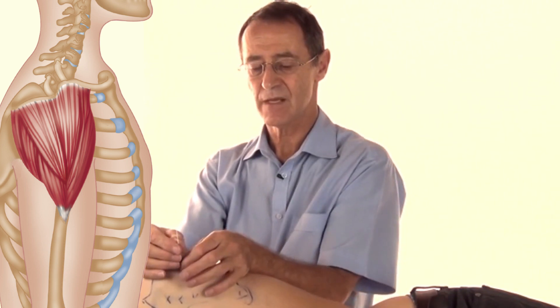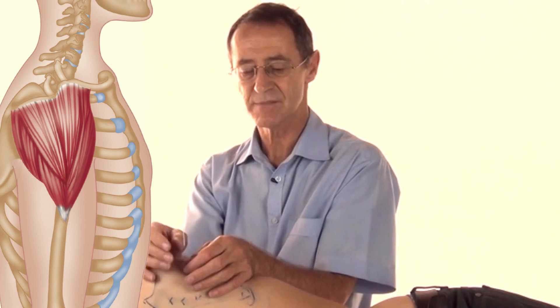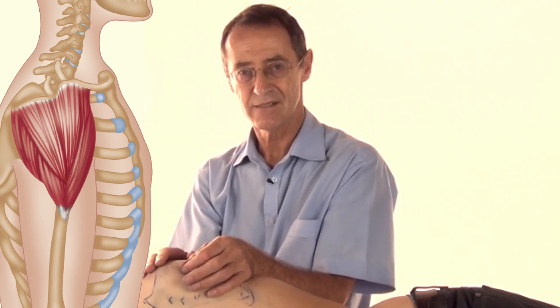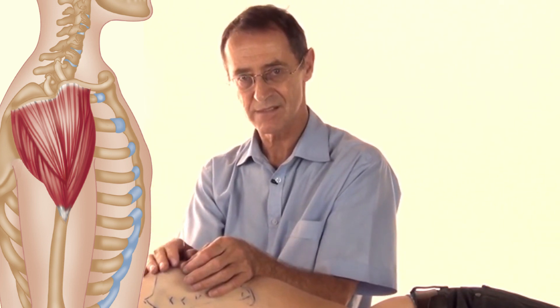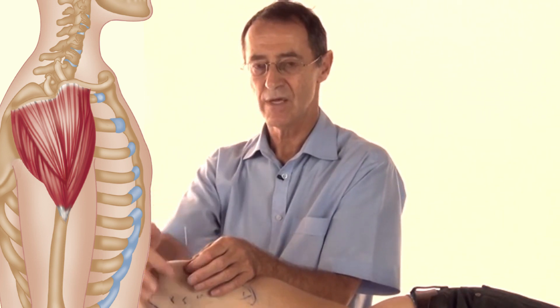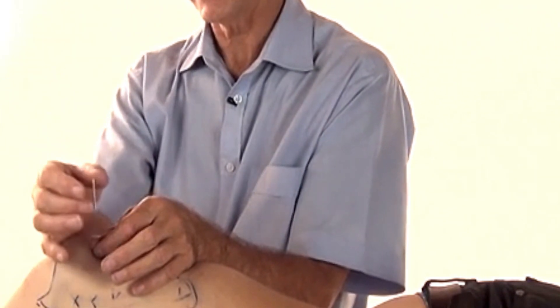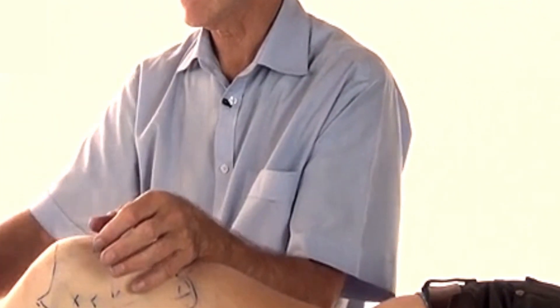Once I'm there, I will twist a little bit to increase that feeling of needle grasp. I leave the needle in — normally for 10 minutes — and then take it out. I put in as many needles as I need to when I'm treating, leave them for 10 minutes, then take them out.